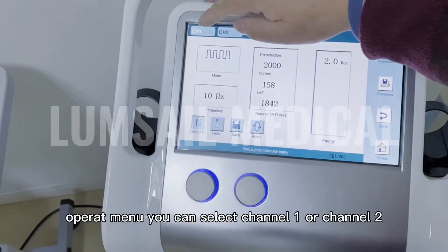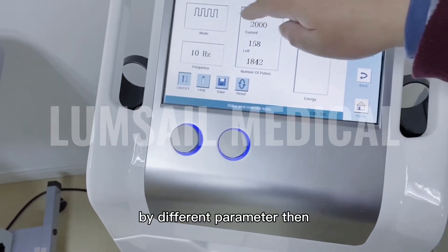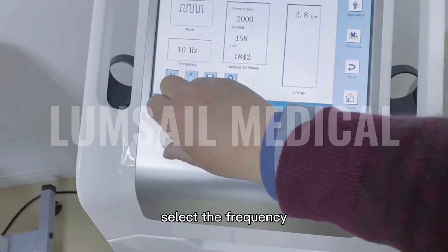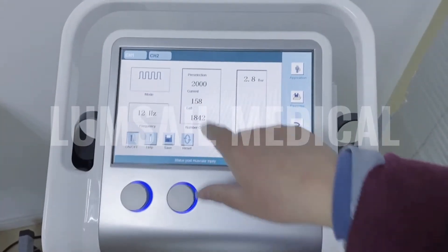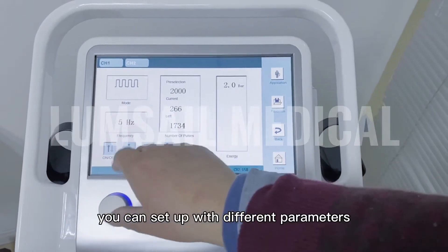On the operating menu, you can select channel 1 or channel 2. With different parameters, you can select the energy, select the frequency, and switch to another channel. You can check and set it with different parameters.